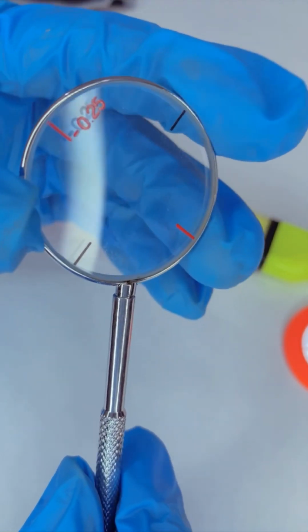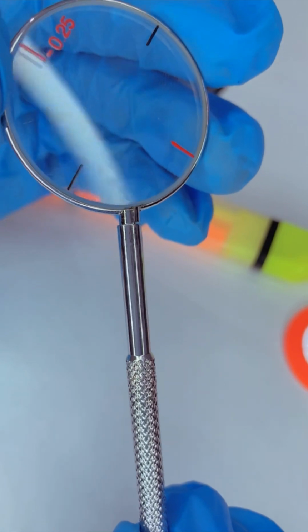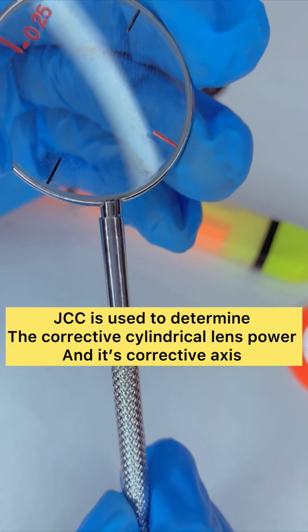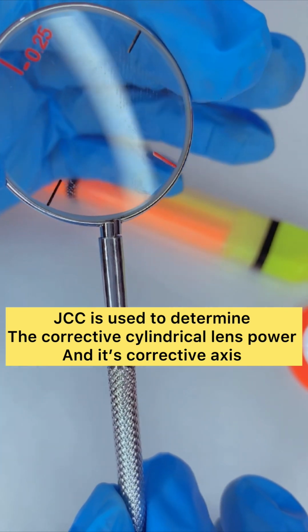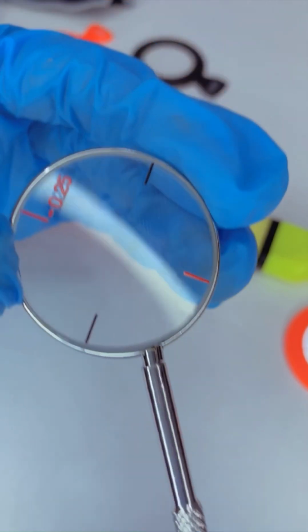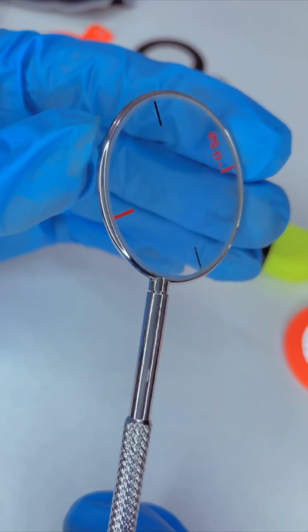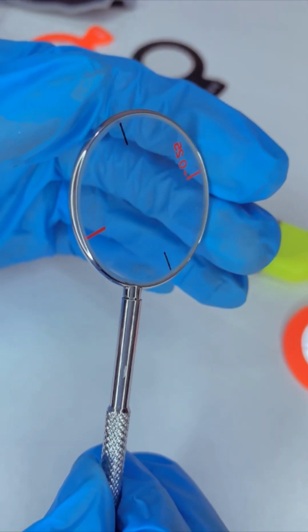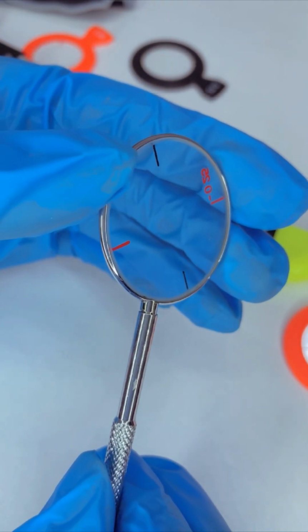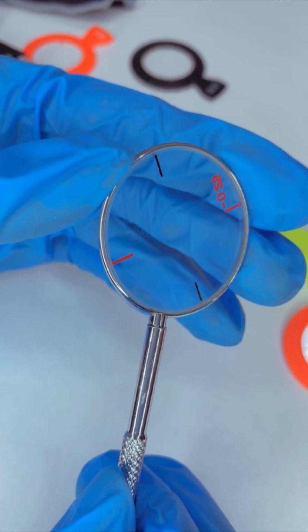Now, JCC, in short, Jackson cross cylinder, is used to determine the corrective lens power and its axis in patients with astigmatism. So this JCC can easily refine the axis and determine the corrective power and the corrective axis.